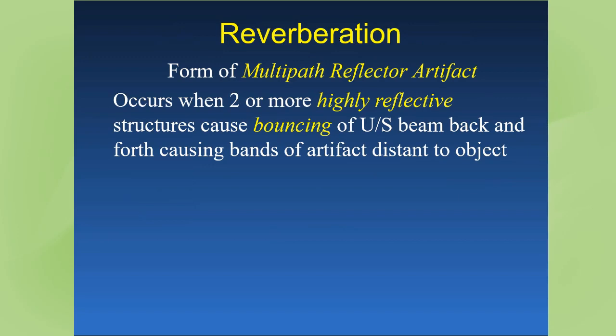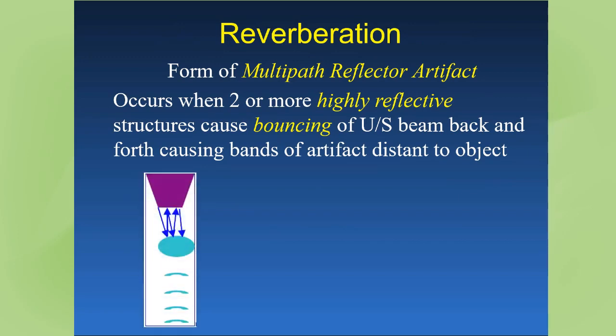So here's a nice illustration of that. Bounces back and forth. Again, one of the mirrors is the transducer, the other is the object. And it keeps saying, wow, it's getting longer and longer and longer. And so there must be this same object further and further and further away.